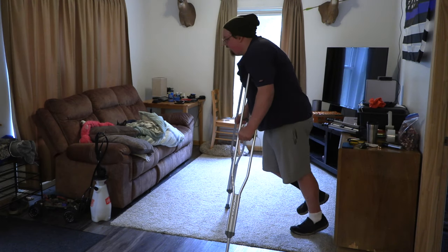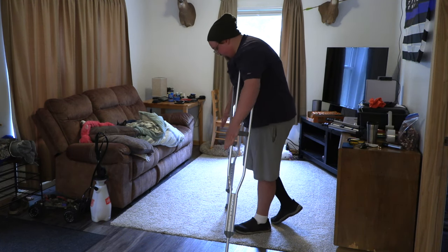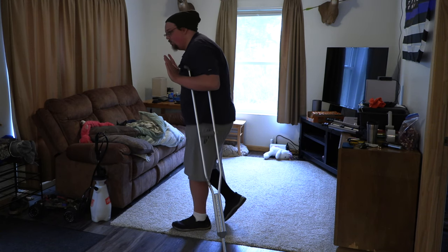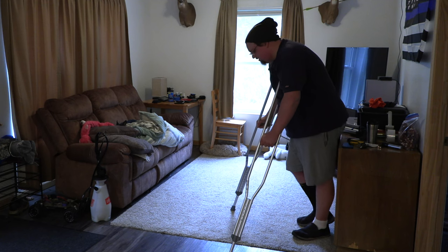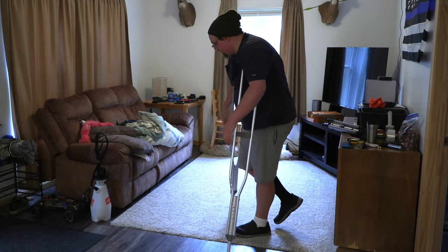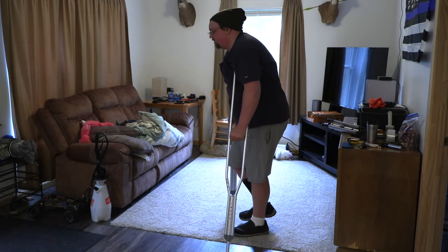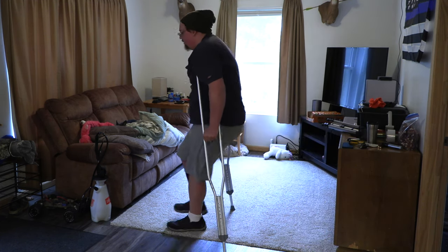Once I got comfortable with that, I started shifting forward a little bit. It's important to note that my crutches are straight relative to my body, and my foot is not going past the crutch line. If I go just a little bit past this, gravity is going to want to push me forward and you can lose your balance if you're not familiar with this yet. So once I got comfortable transitioning and putting weight on the crutches, I started moving my foot forward — not past the crutch line — moving it back and forward, feeling the weight transfer. Just getting used to that.